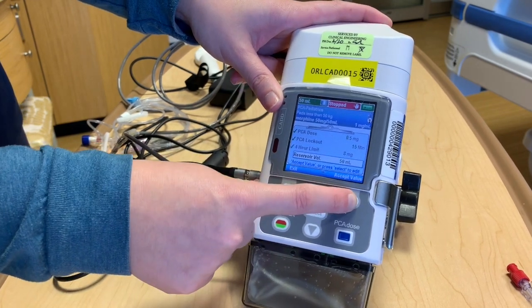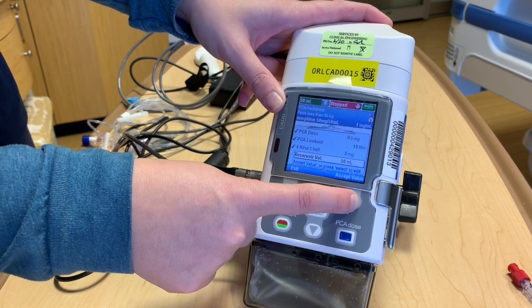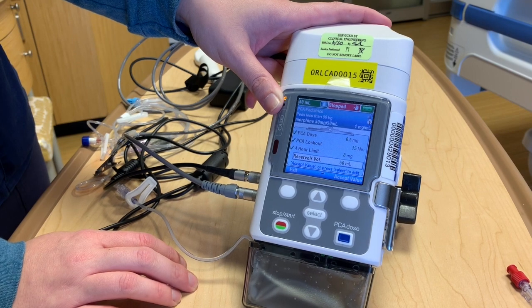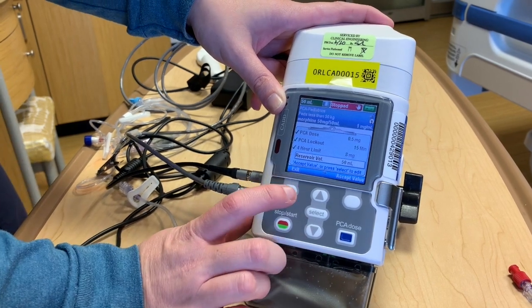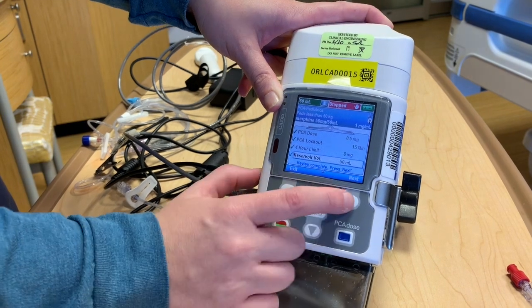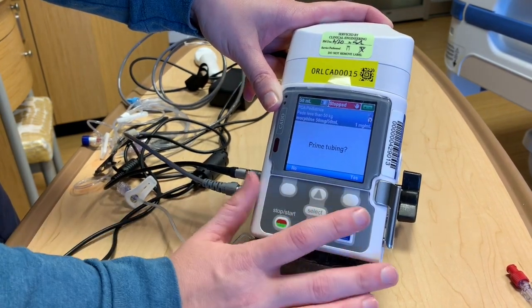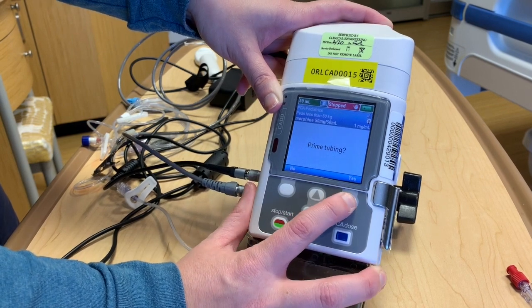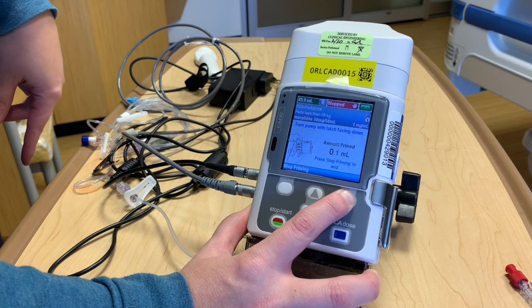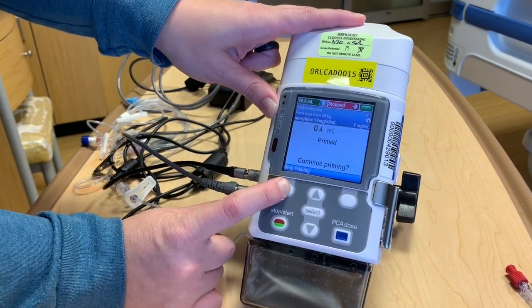There's the PCA lockout, the four-hour limit, and then this tells you how much reservoir volume you have — it shows 50 ml within the cartridge. After we accept all those, we'll push next and it's going to ask us to prime tubing. You always just need to make sure that the tubing is not connected to your patient, so we'll say yes and push prime. It'll prime all the way through the tubing, and once it's primed through we can push stop prime.